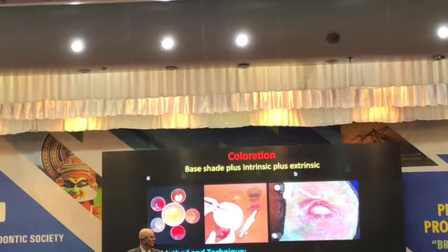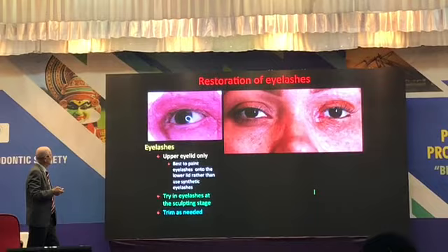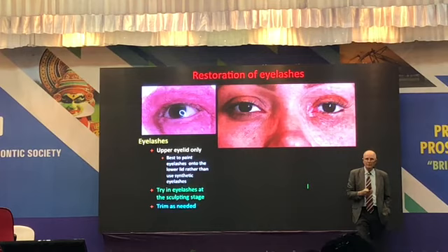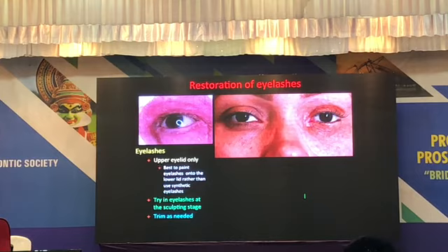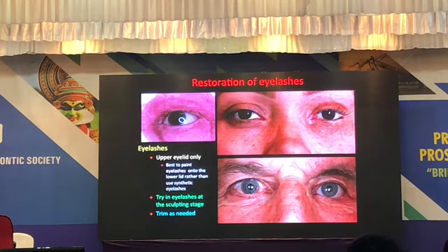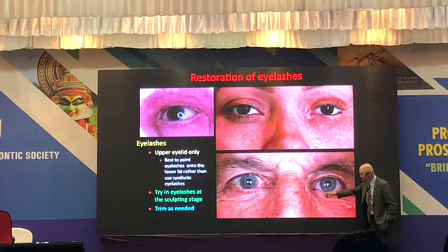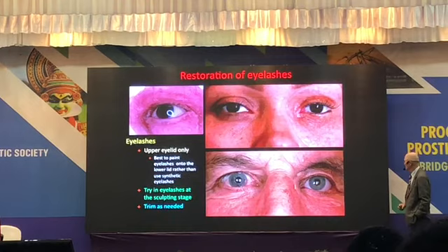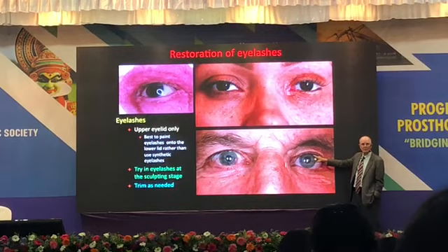As I said, upper eyelashes, we use synthetic eyelashes for the upper only. Because if you use synthetic eyelashes on the lower, they become too prominent. Mostly, even in the ladies, the lower eyelashes are not prominent. And so we paint the lower lid. So, like these are painted. Those are painted. And you can see the mucosa, the pink mucosa of the lower lid. When you use the synthetic ones, you cover up all that pink mucosa of the lower lid. So it doesn't look natural, does it? So we always paint the lower lashes, use synthetic ones for the upper lashes.